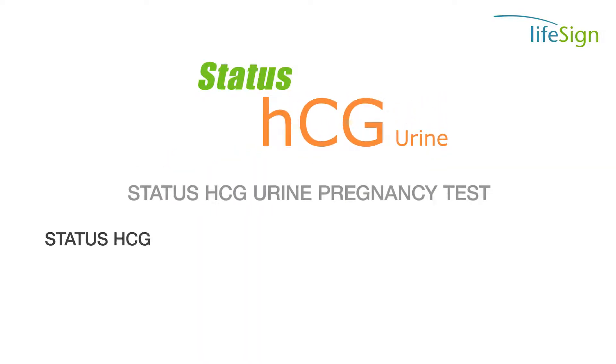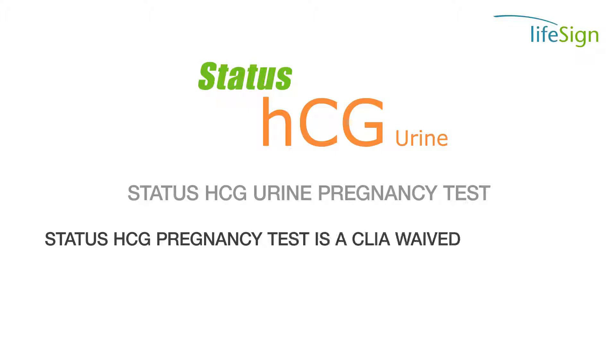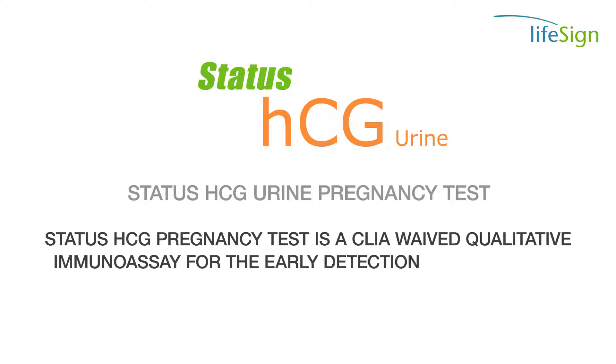The STATUS HCG Urine Pregnancy Test is a CLIA waived qualitative immunoassay for the early detection of pregnancy.